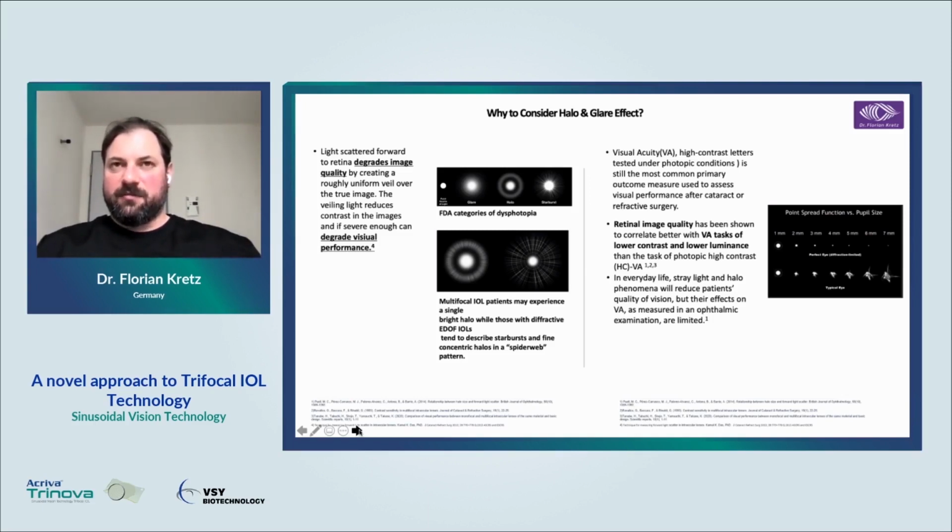which under real life conditions hardly ever happens, because especially those nighttime drivers, look at our displays now and compare your display 20 years ago to a Tesla. Now you have a disco light inside your car while you're driving, while before you actually did have true halo and glare. And in the cities, there's outside lighting too. So your pupil size does not extend to 4 to 5 millimeters anymore at all. It rather stays around 3.5 to 4.